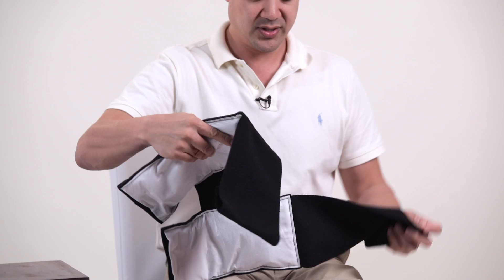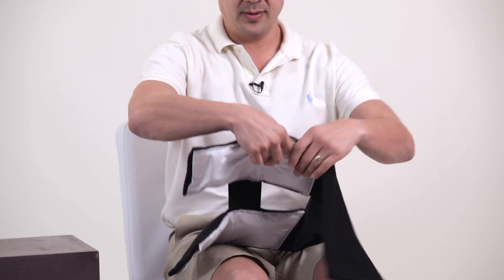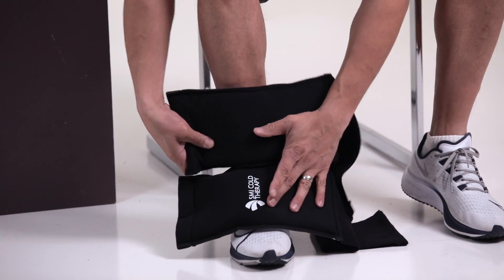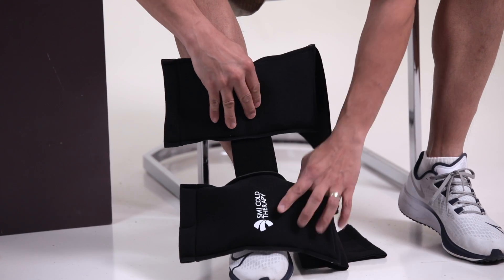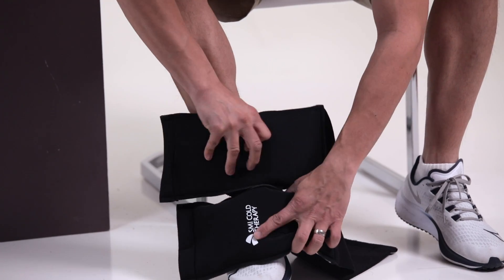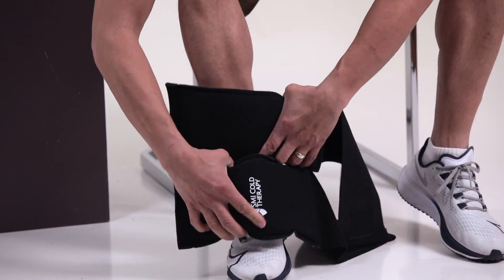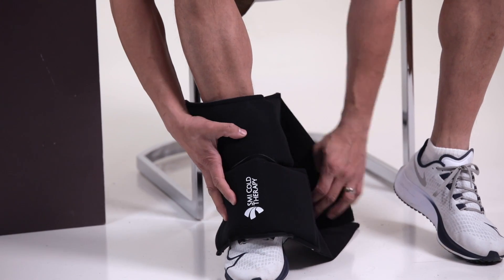First we're going to start with the dorsal application. We want to hit the top of the foot and this part of the ankle. This strap in the middle is here depending on if you want to hit different areas of pain. In my case I want both of these to be together.